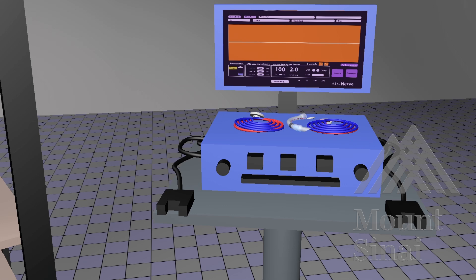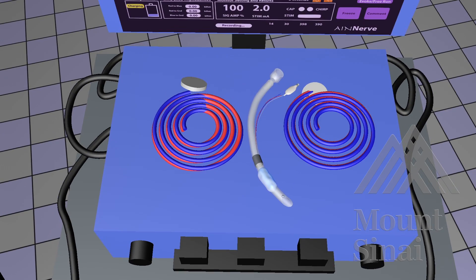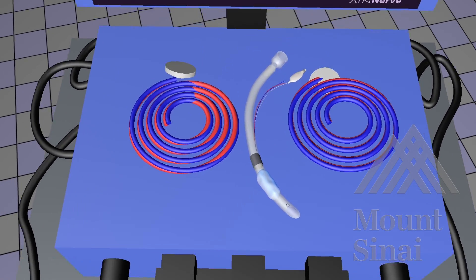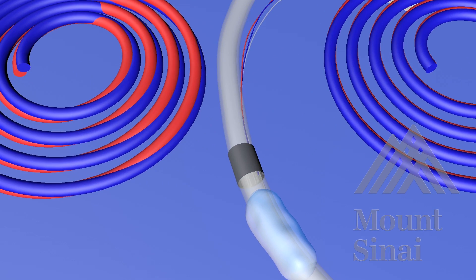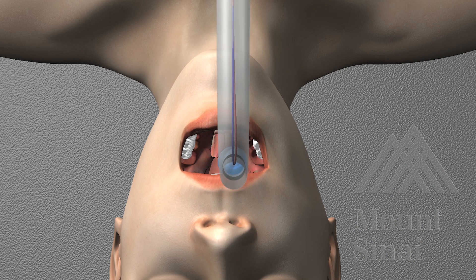We routinely use intraoperative nerve monitoring during this procedure to gauge the integrity of the laryngeal nerves during the dissection of the thyroid lobe. To set up the nerve monitor, we use an endotracheal tube equipped with monitoring electrodes. Insert the endotracheal tube in the usual fashion.